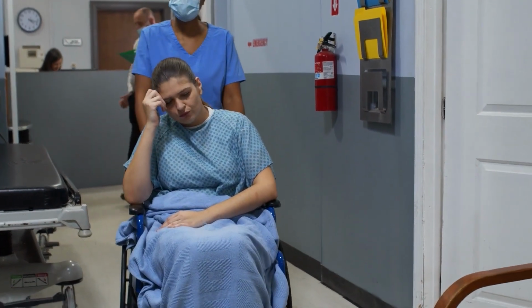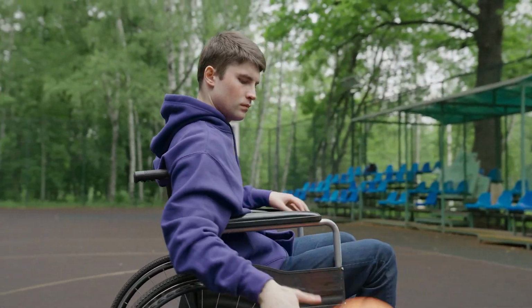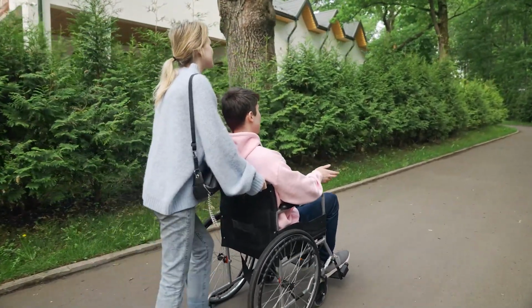Individuals with impaired mobility often require the use of a mobility aid to perform daily functions. These aids come in a wide variety of shapes and sizes, but two of the most common are wheelchairs and transport chairs. Although they look very similar, they are distinct types of mobility aid and should be considered as such.